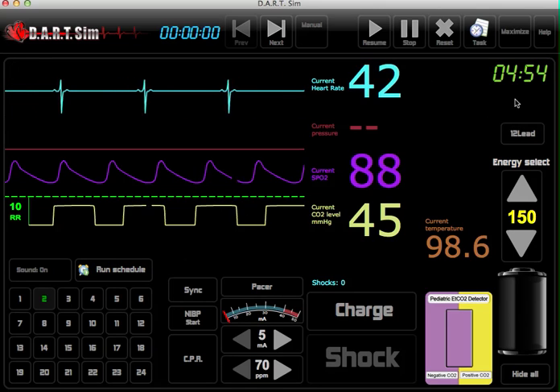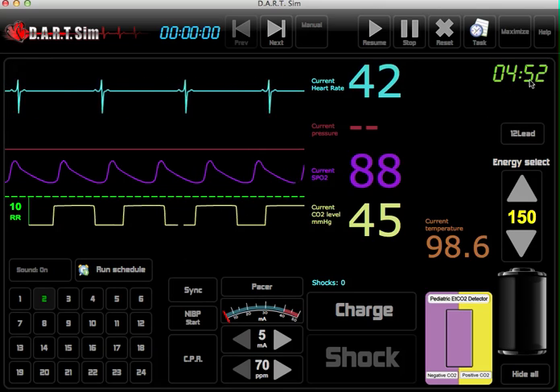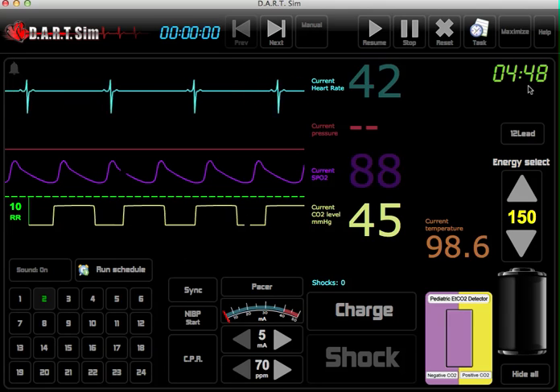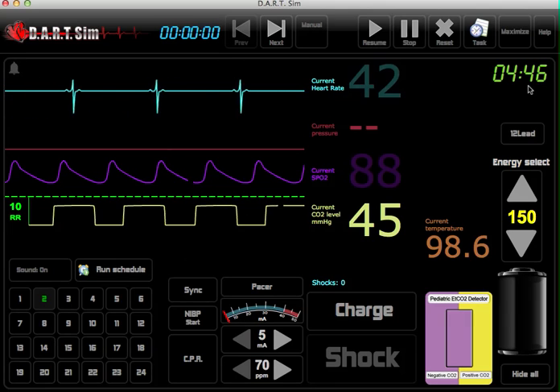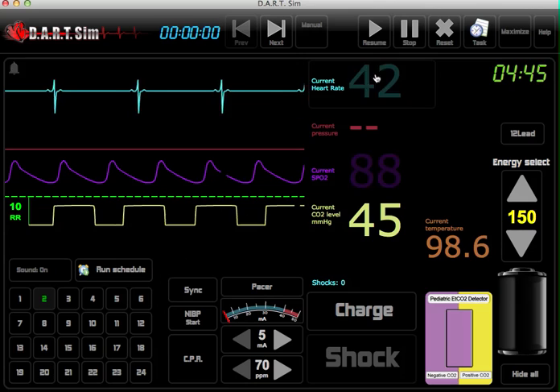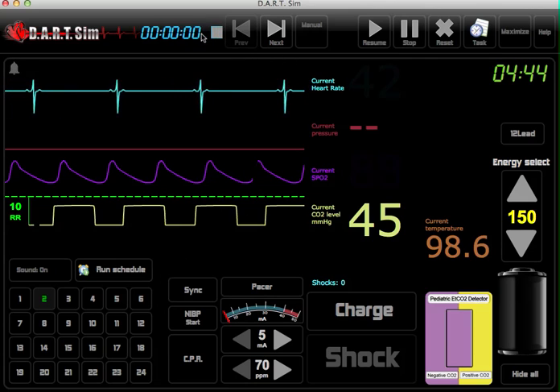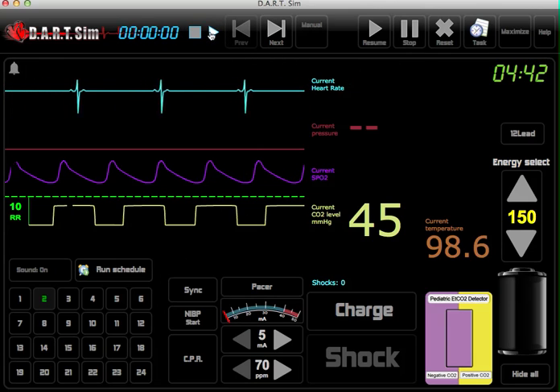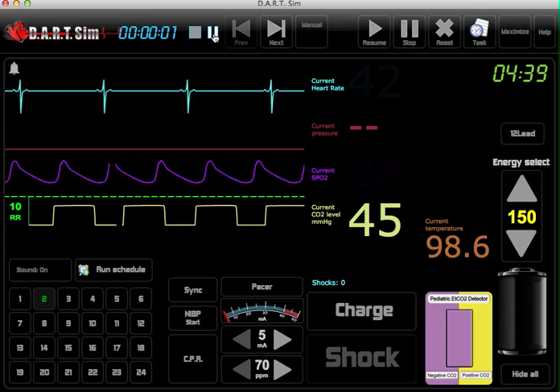Up in the top right corner here it lets you know how much time you have until the next scenario will be displayed. You've also got a code timer up here on the top — just click on that and it keeps track of real time.